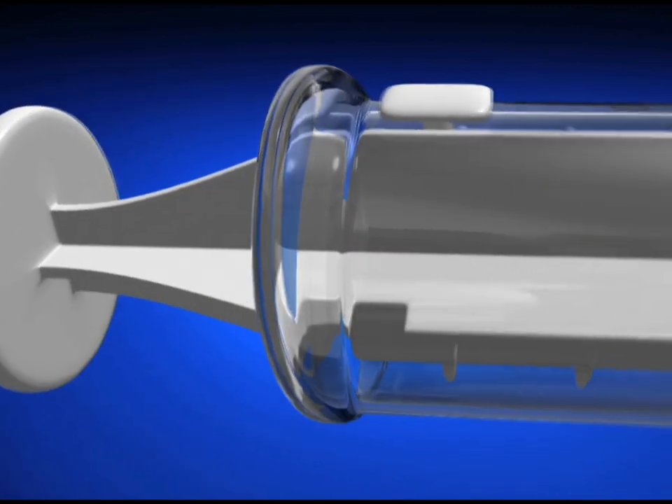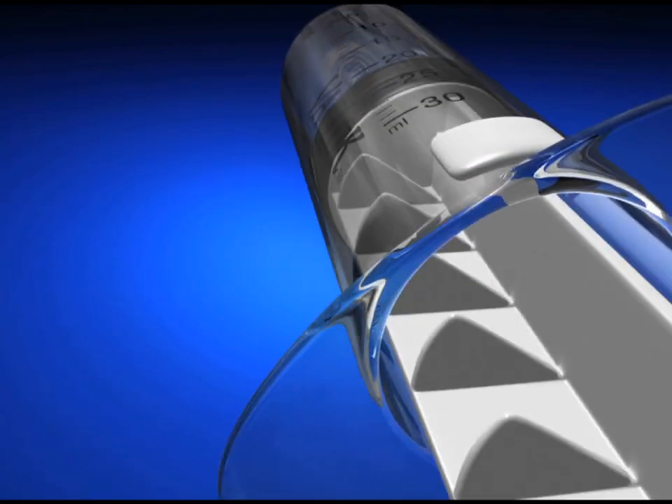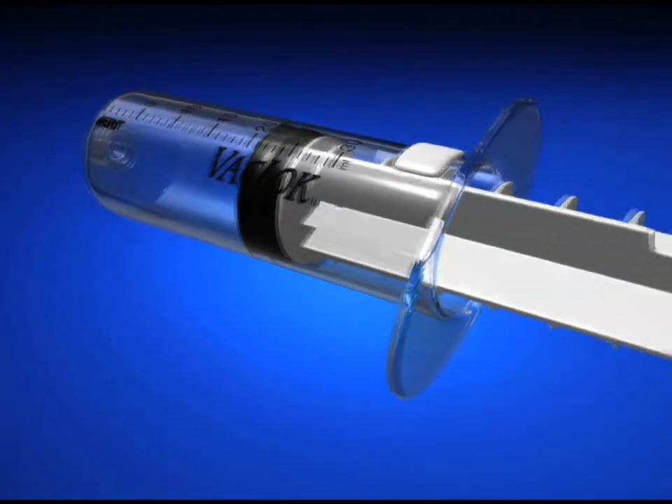The white plunger is designed with unique locking fins that allow the user to pull back, create a sustained vacuum, and lock the device in place.